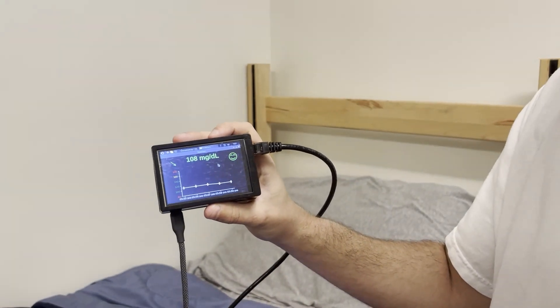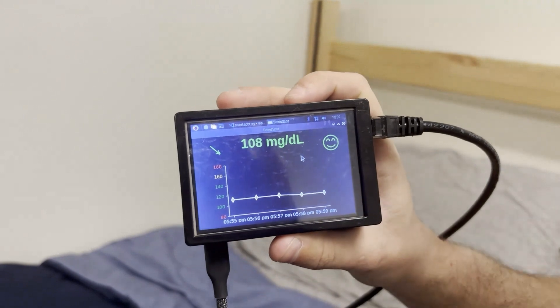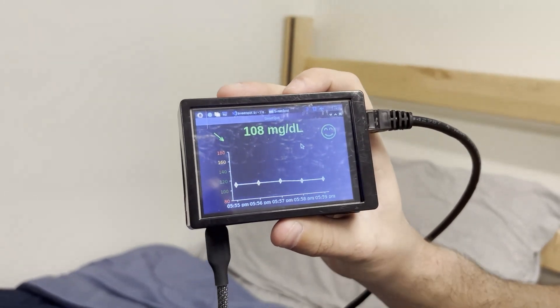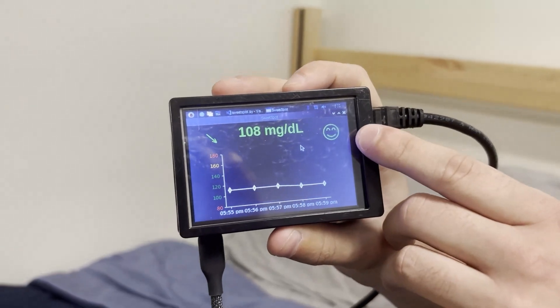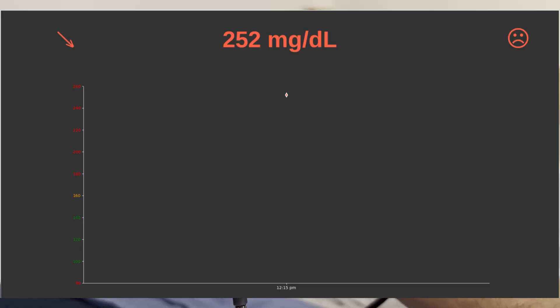So this is Sweet Spot up close. Right here is the current blood sugar value. Here is a smiley face or frowny face depending on if you're in range or slightly out of range. If you're in range it's going to be a smiley face like you see here. If you're slightly out of range it's going to frown at you, and if you're really out of range it's going to frown at you.